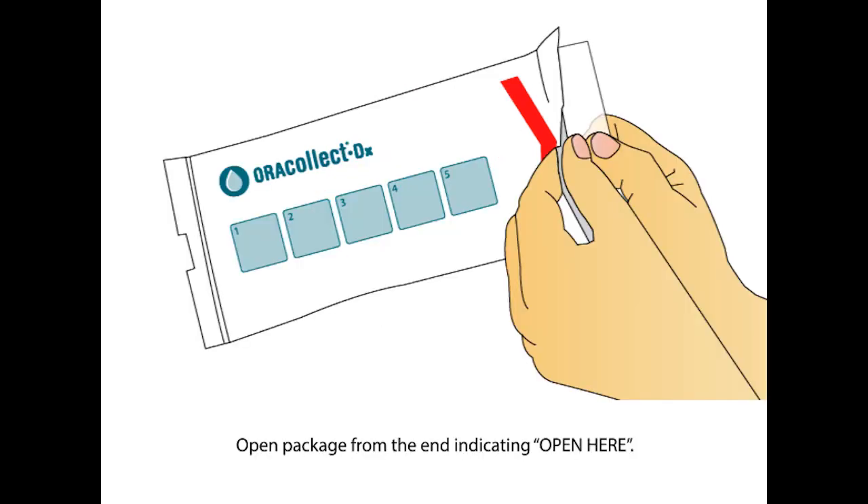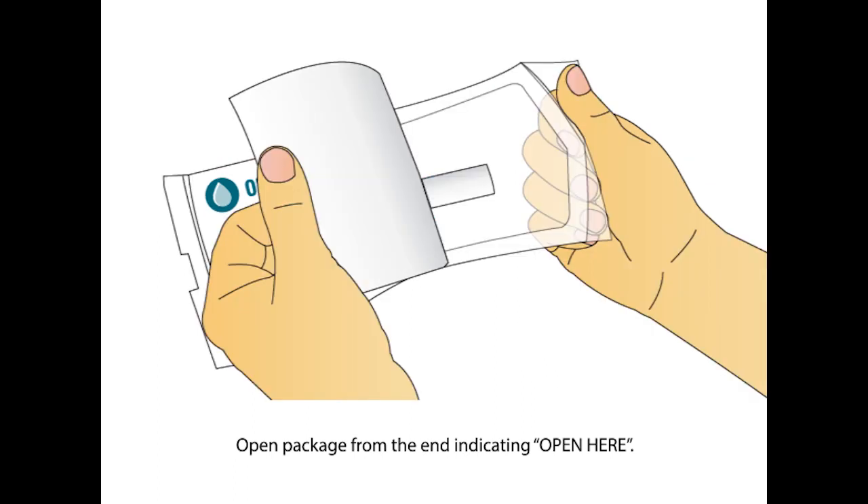Open the package from the end with the open here arrow. Remove the collector by its handle from the packaging.